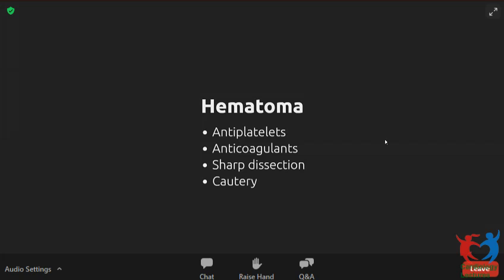This kind of acute rise and subacute rise in threshold that tends to happen in the first 4 to 6 weeks is very much mitigated now with steroid eluting leads. So that is not that much of an issue. And the other thing to mitigate that is that most of the devices come with a higher programmed output. Like Medtronic devices, it's at 3.5 volts when it comes in factory settings.